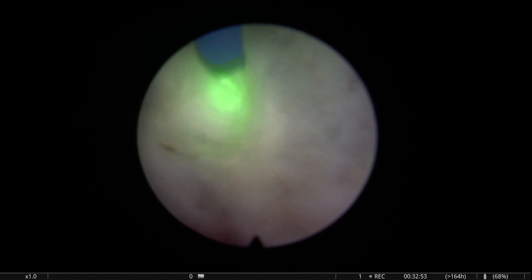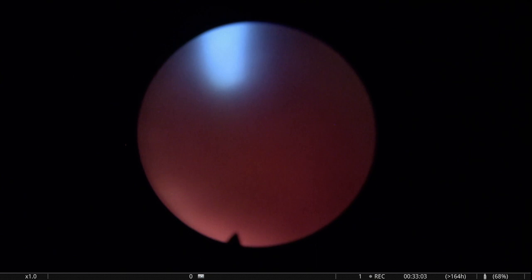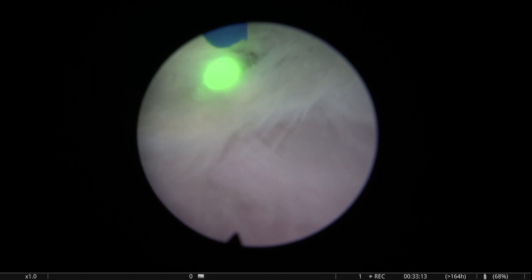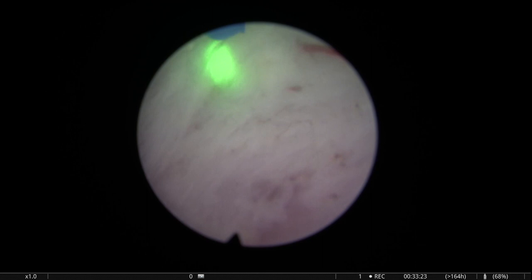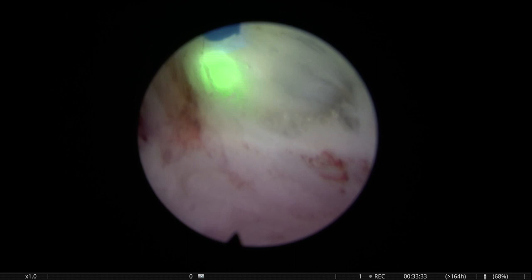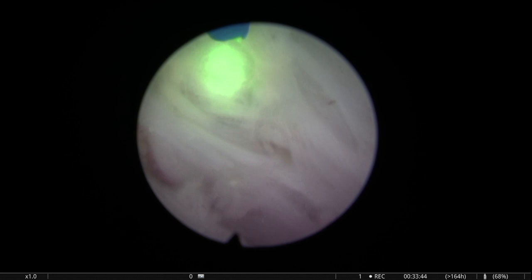Also, I have to say, cultivating this patient approach to HoLEP, in the sense that you are progressing slowly and you're not wanting to rush it, just trying to add a little bit to the operation by doing something which is correct, which is good, which is safe, which enhances visibility, which helps you progress through the case. This prepares you very much for the very large glands. When you do very large glands, it is very important to be patient, to be calm, and to progress. This philosophy will take you to finish the case.